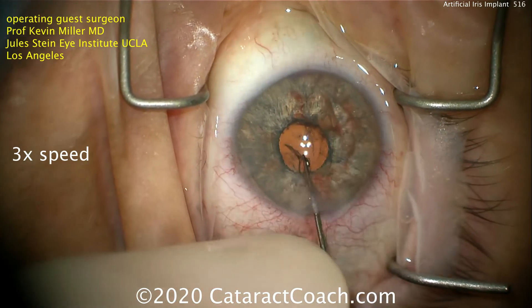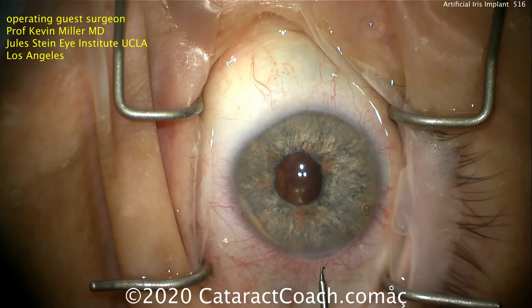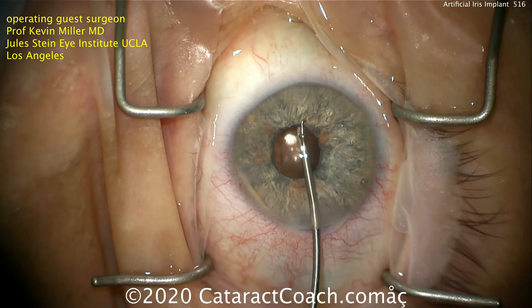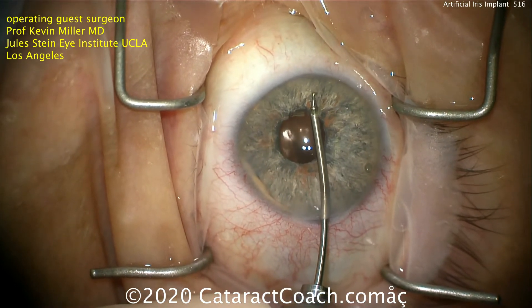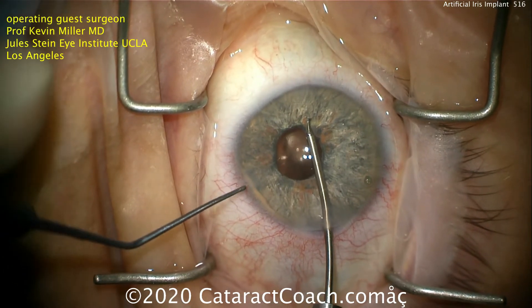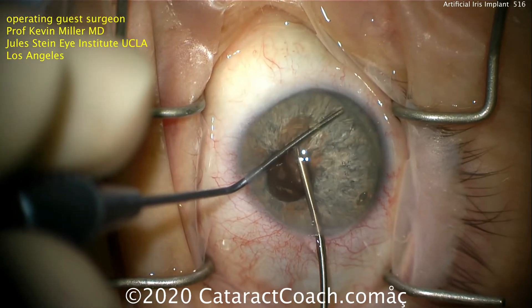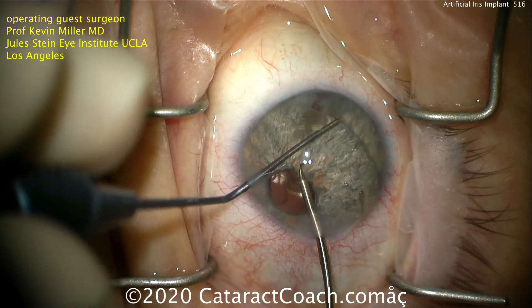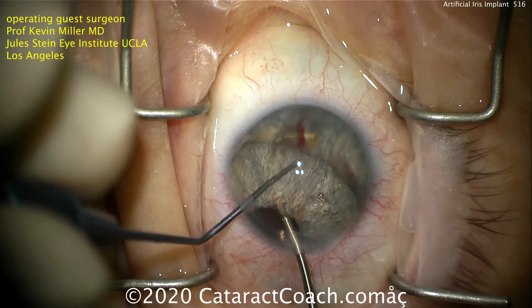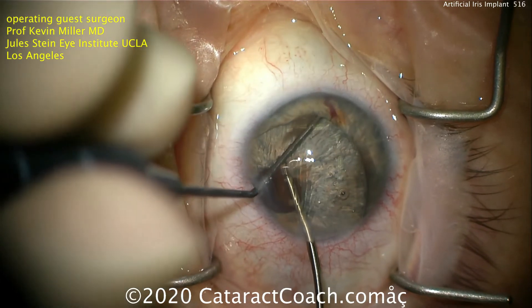And that's not such a simple thing to do because it's very large. So it was injected in front of the iris, and now it's going to be positioned very carefully behind the remaining iris. This is a neat technique — we're just going to use one hand with these micrograspers, and on the other hand a manipulator, in order to get this big, humongous artificial iris placed behind the existing iris in the sulcus.